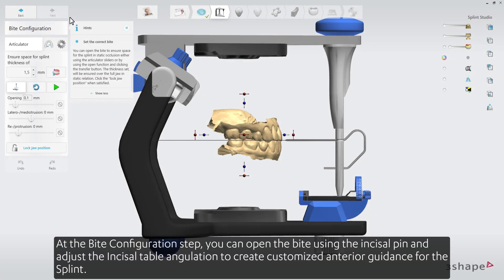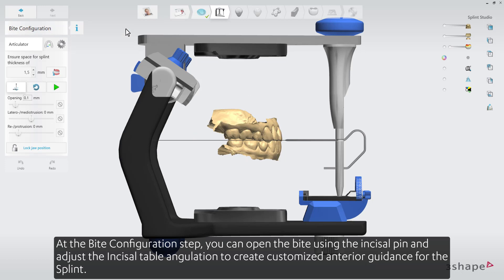At the bite configuration step, you can open the bite using the incisal pin and adjust the incisal table angulation to create customized anterior guidance for the splint.